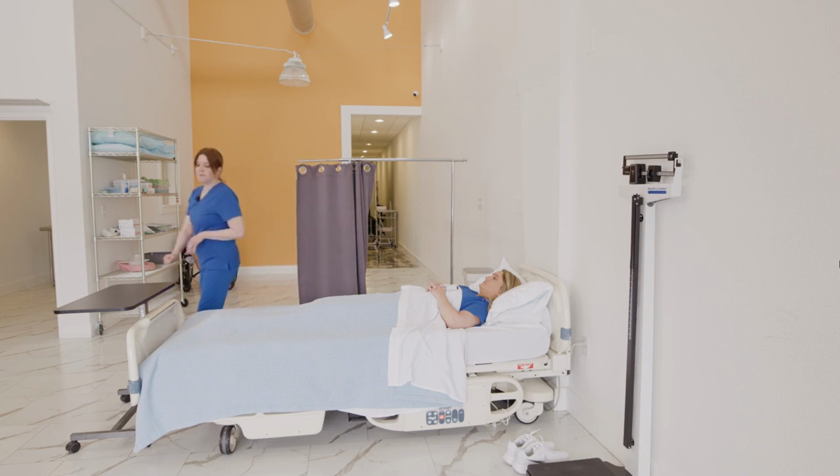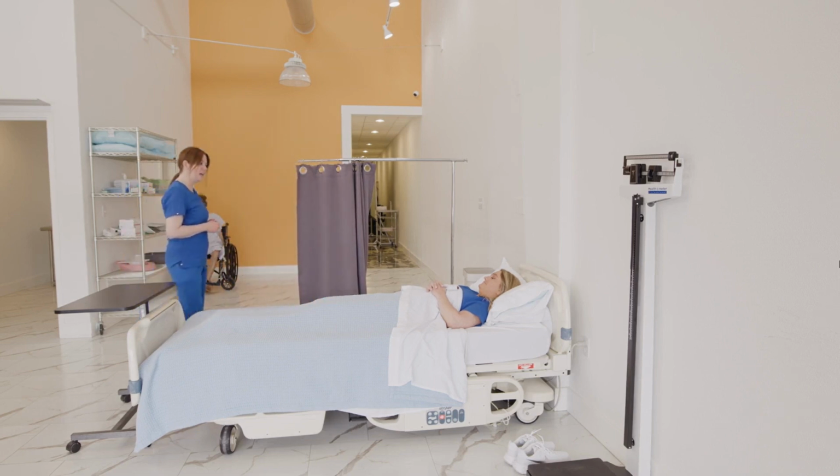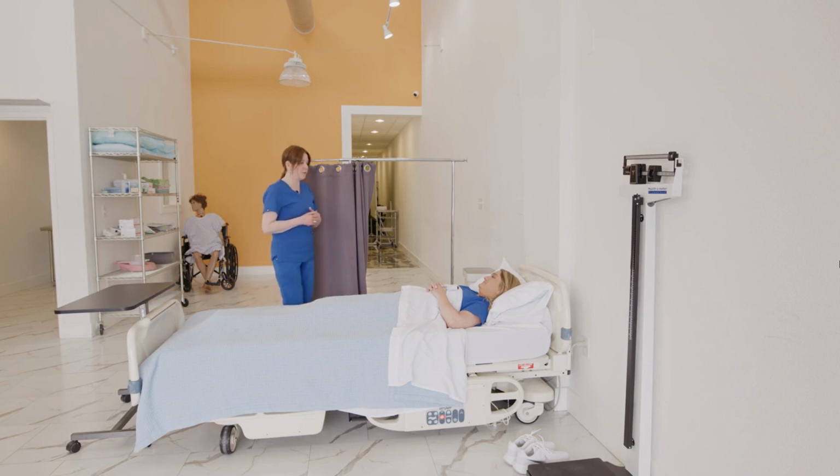So, knocking. Good morning, Miss Megan. My name is Teddy. I'm your student nurse aide, and I am here to walk you to your scale to get your weight today. Is that okay?